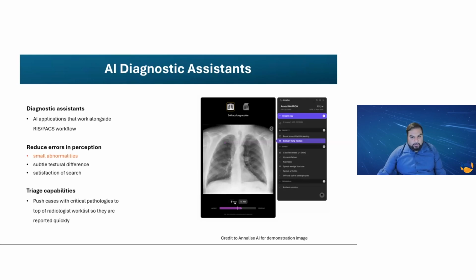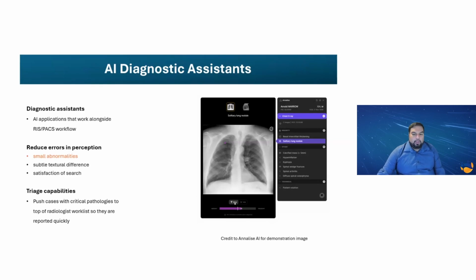Some things are easier to miss than others in radiology, and an abnormality that is very small is always at a higher risk of being missed. These image interpretation deep learning AI systems can interpret the image in very small groups of pixels, so they're exceptionally good at picking up small things, like the tiny lung nodules you see in this little GIF image. This sort of technology is proving now to reduce mortality due to lung cancer through early detection and treatment around the world.